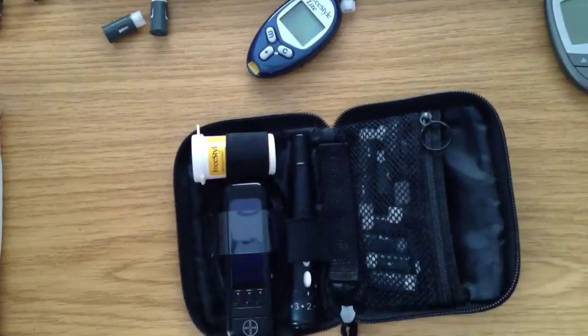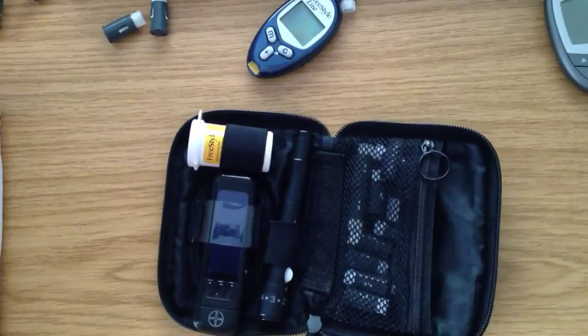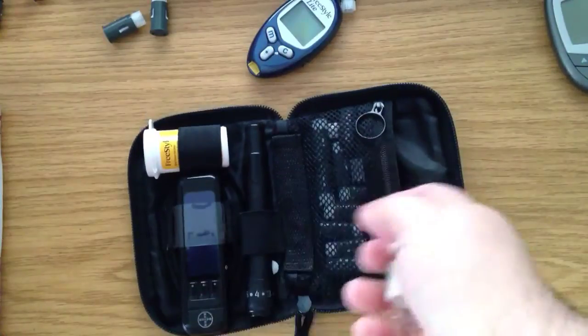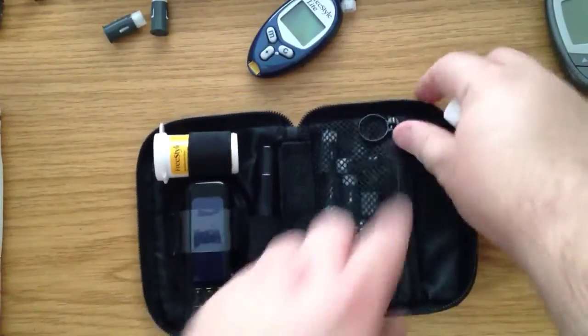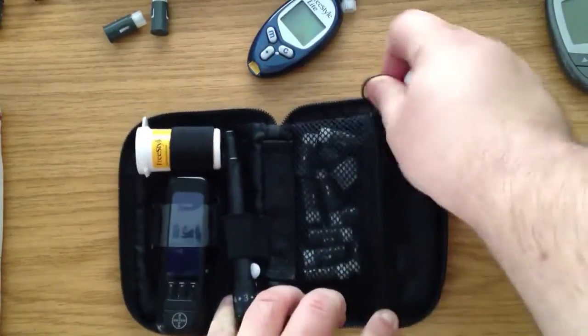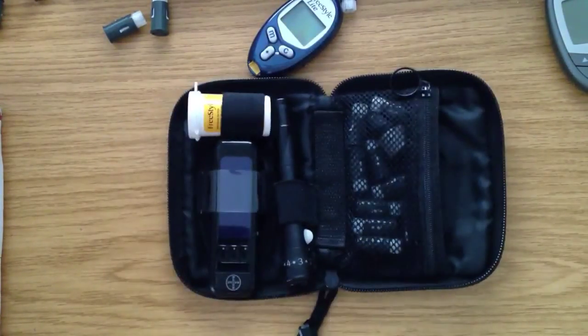There is a finger pricker loop here, where you can put the Fast Clicks in, but again, if you're not careful, you open the case, it falls out. There is also a zip pocket here where you've got all your lancets, your AST cap, if you want that, and then a little pouch, which, to be honest, I find is actually pretty good.